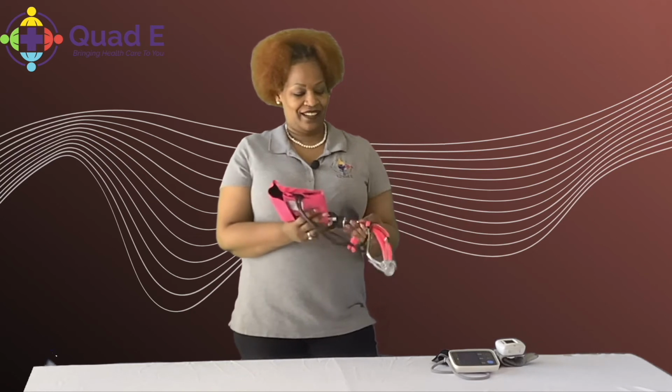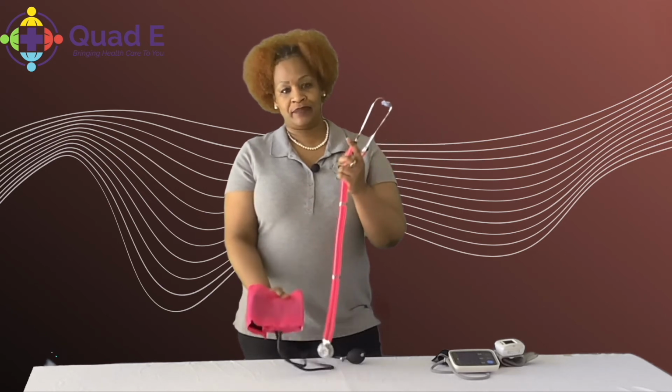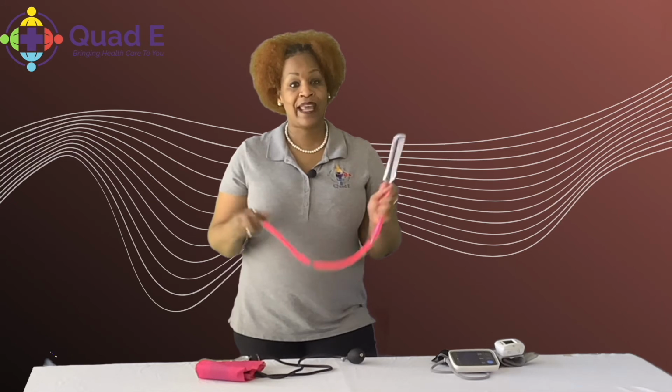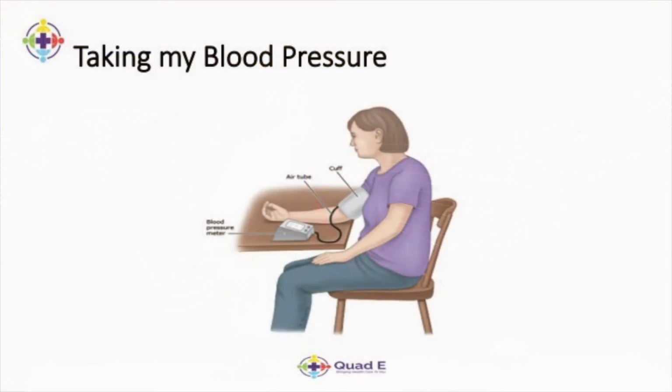This one is the one that you have in nursing school. Everybody remembers that. But this is the manual one. If you have a home health nurse, she probably even has one of these right here. Now, pink is my favorite color, so you don't have to go ahead and get a pink one. Okay, so this right here, you want to make sure you have a really good stethoscope.